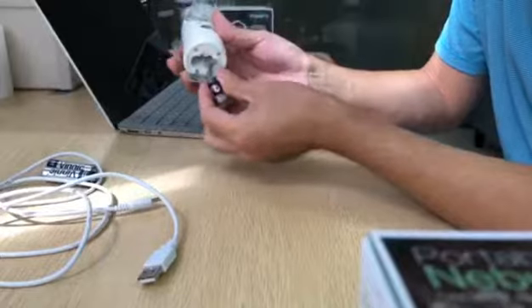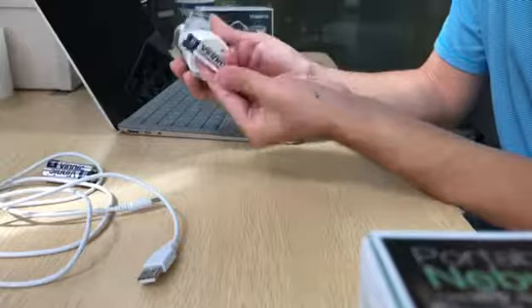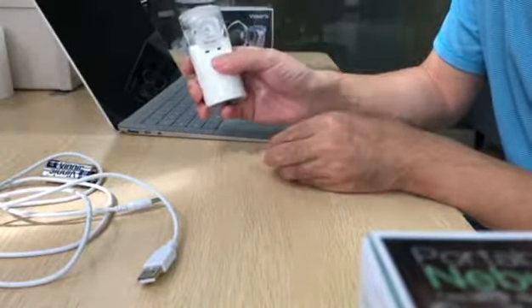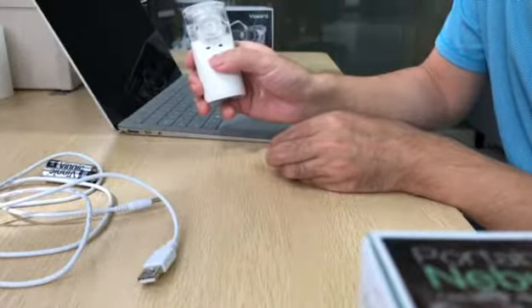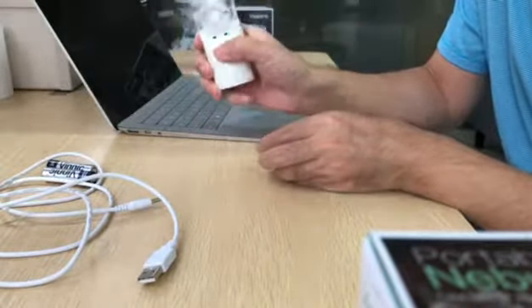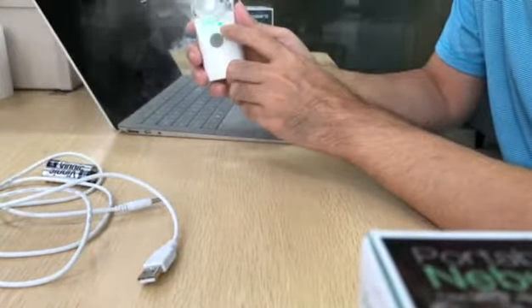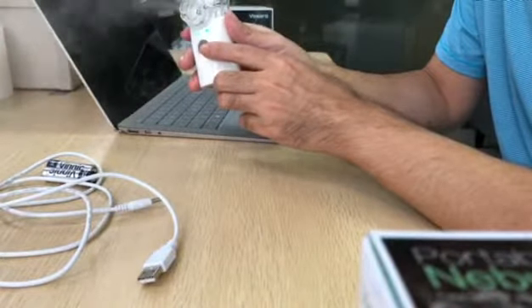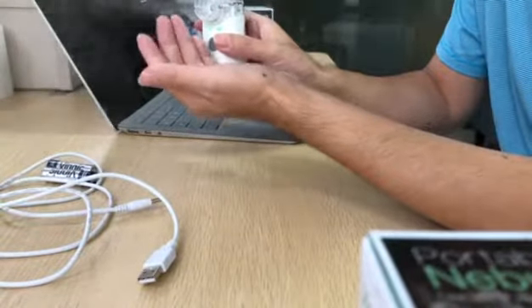Actually, based on our testing result, this kind of battery can work more than 6 times, 15 minutes each time. Now you can see the green lights, 2 green lights. That means this nebulizer can work for you. It's a very fine mist.